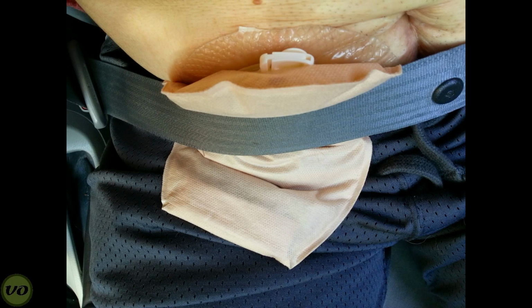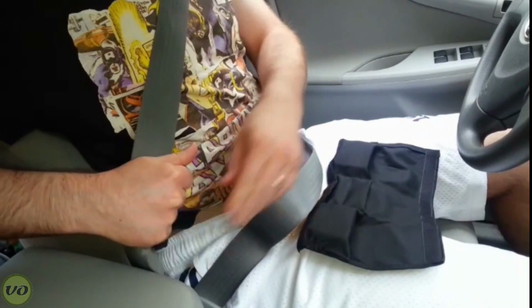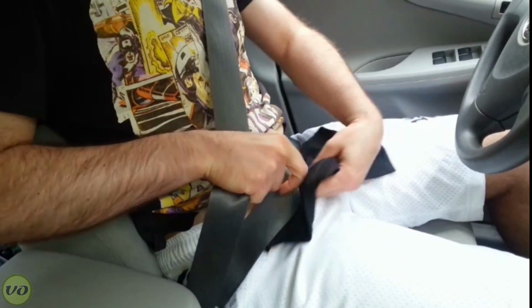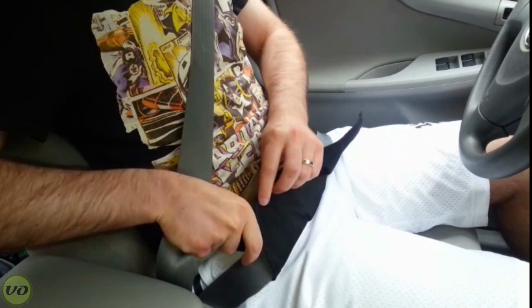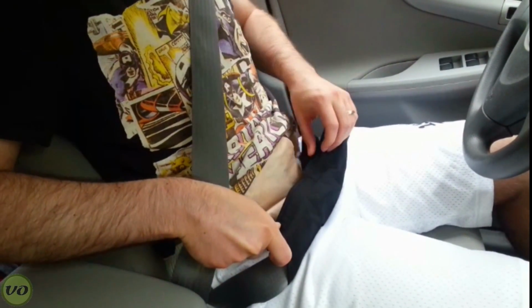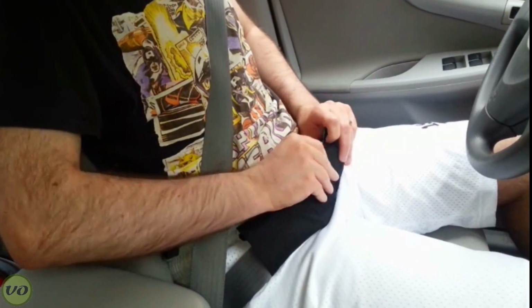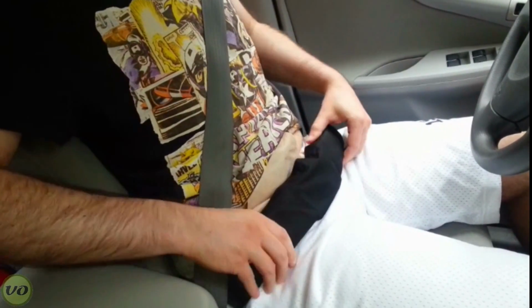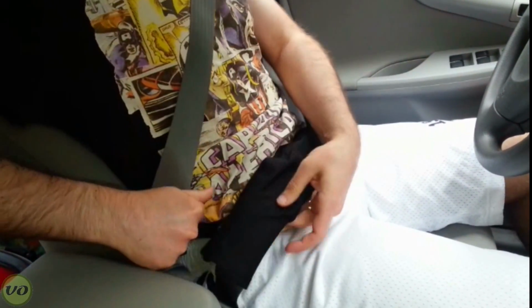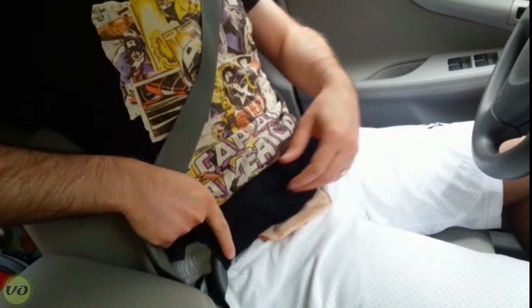Now, if you have a stoma that is interfering with the way you wear your seatbelt, seatbelt covers are a nice option to have in your car. Now, the aim of a seatbelt cover is mainly to protect your stoma from your seatbelt, so you don't have to modify what you're wearing just to make your ride more comfortable. I find that these are super convenient to use, and they really do make the ride a lot more comfortable, but they're really only necessary if your stoma is right over your seatbelt line.